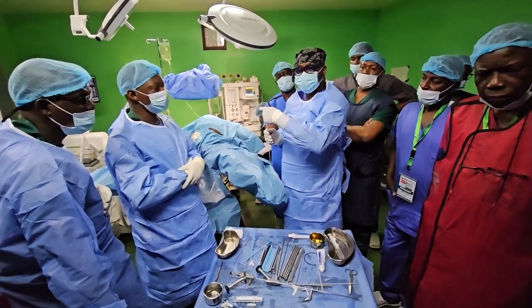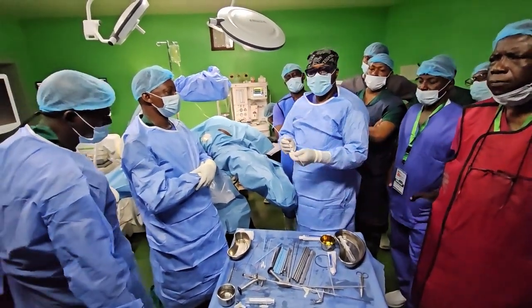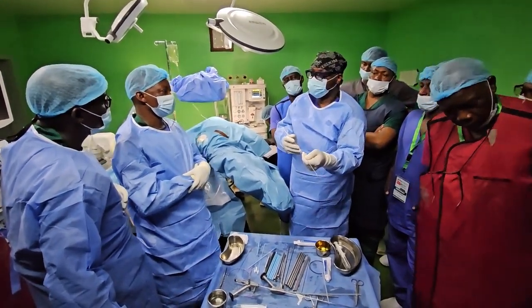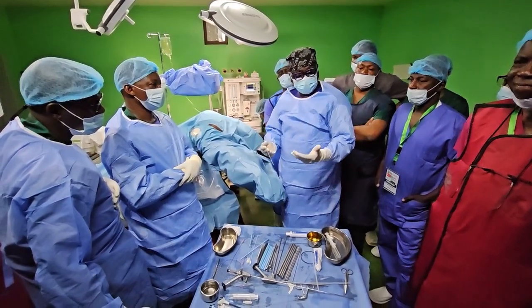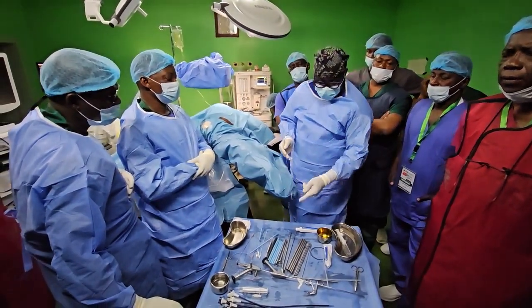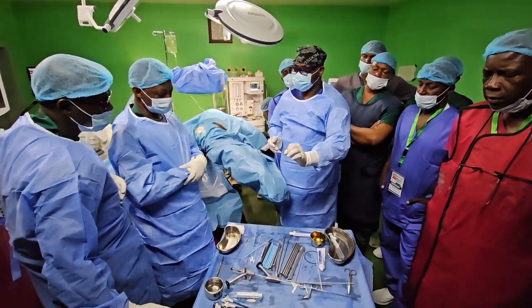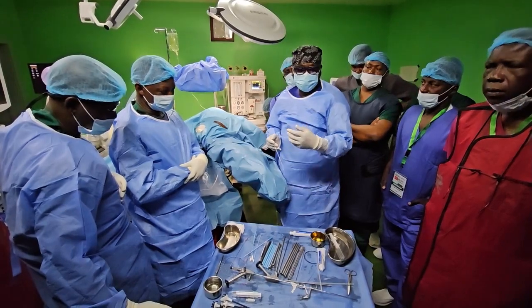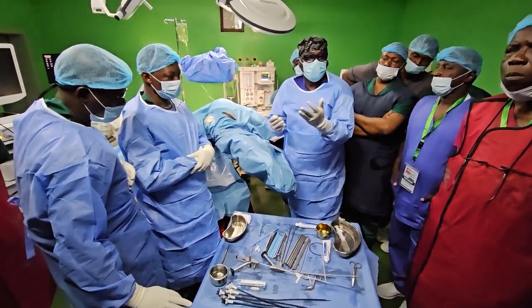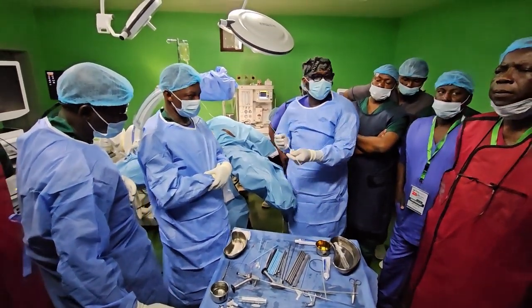And you are controlling it with fluoroscopy to ensure that you don't overdilate. If you overdilate, you are going to go across the infundibulum, shear it, and then you can bleed. But again, the beauty of mini PCNL is that we are using small Amplatz sheaths. So even if you overdilate, it's going through an infundibulum that can accommodate it. That's one of the beauties, but you must always be careful so that you don't overdilate.